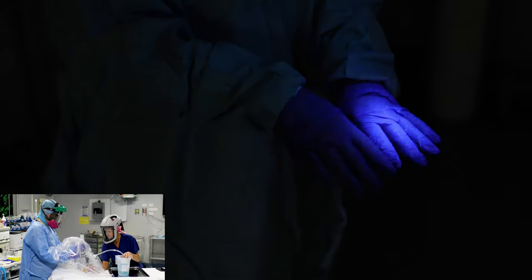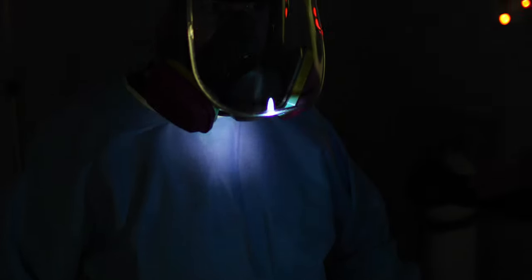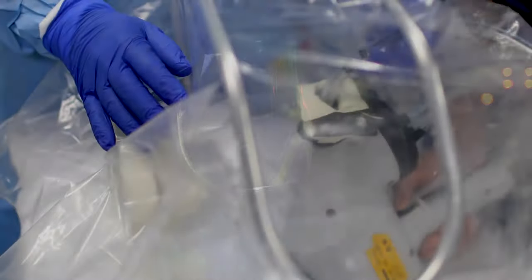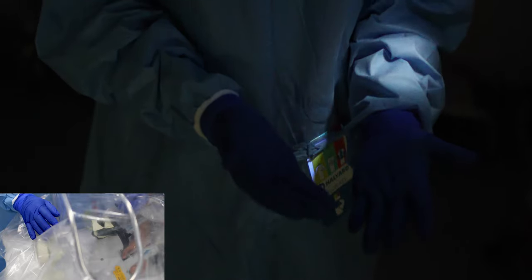A cough during intubation in an aerosol tent resulted in mild contamination of my hands, forearm, and lower torso. Here, we're testing extubation with hands completely outside the aerosol tent. We were unable to detect contamination, although we didn't perform a 3-second burst for this test.